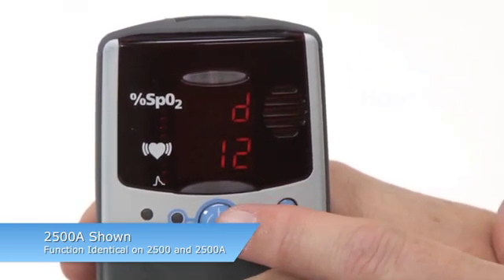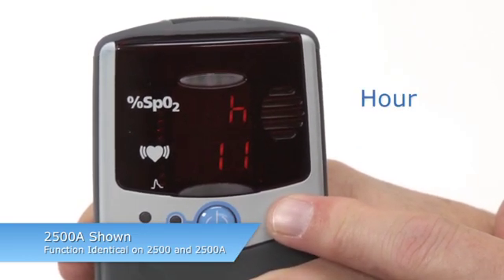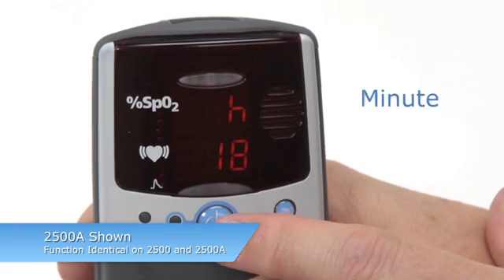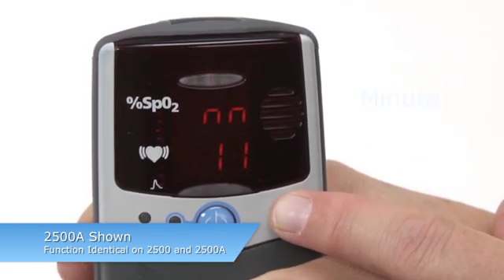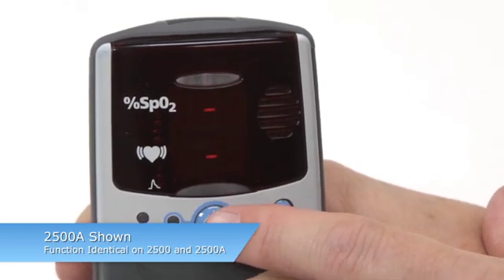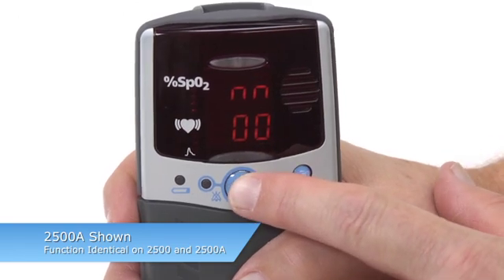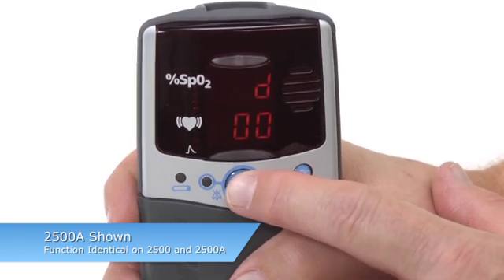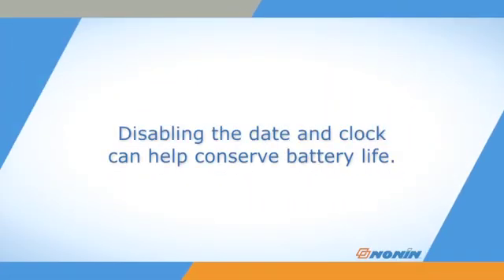You can also scroll through values by pressing and holding the ADVANCE button. Once you set the minute value for the clock, you will exit Setup Mode. You can disable the date and clock settings by setting the month at 00. If you confirm that setting, you will immediately exit Setup Mode. Disabling the date and clock can help conserve battery life.